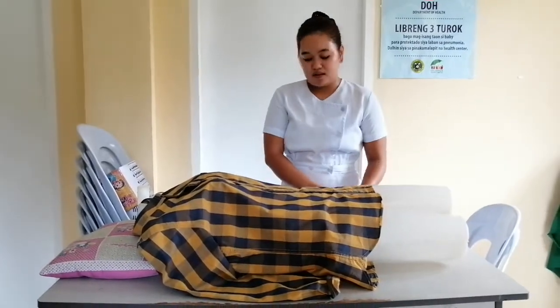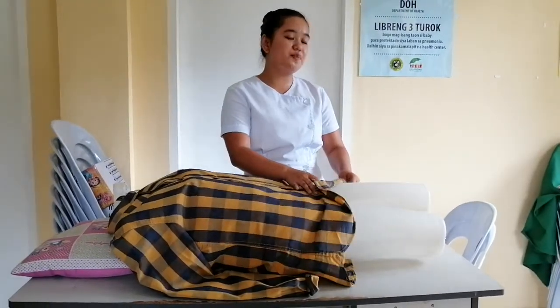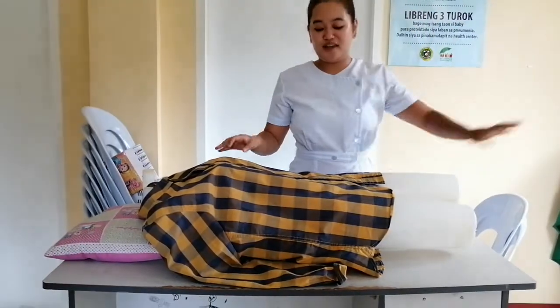And then after doing that, you're now going to provide privacy to the patient. It is important to provide privacy to the patients because you're going to expose the critical parts or the private parts of the patient. So if you are enclosed with the curtain, you need to close the curtain. So assume that I had already closed the curtains.